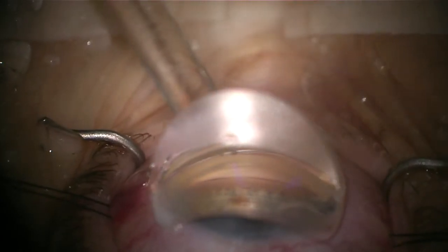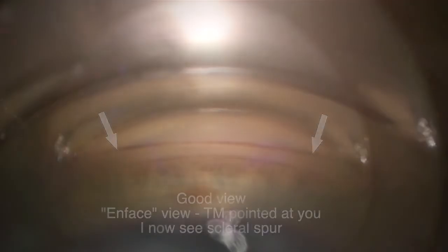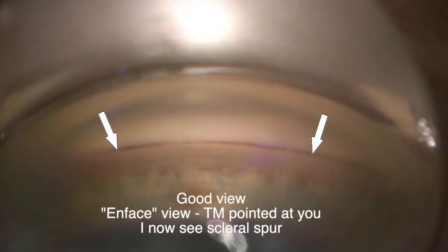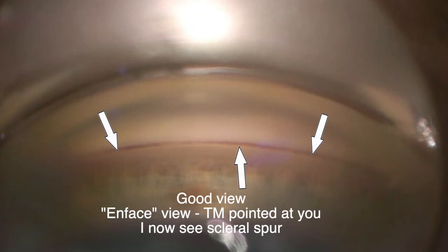Now I have a beautiful view of the trabecular meshwork, and also a good view of the scleral spur and the ciliary body band. This view is important — it's almost like the TM is facing me directly and perpendicular to me. Now I have a good view of the trabecular meshwork, and you can also see with this arrow the scleral spur as well.